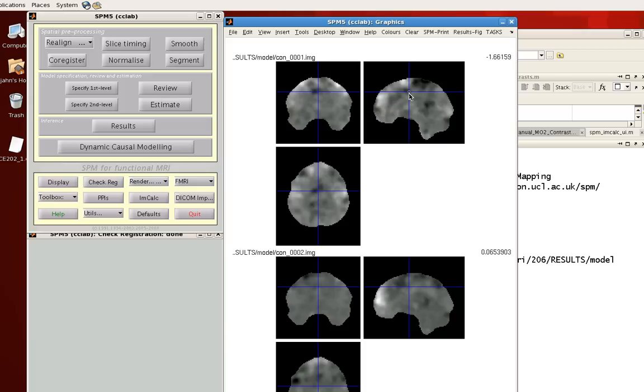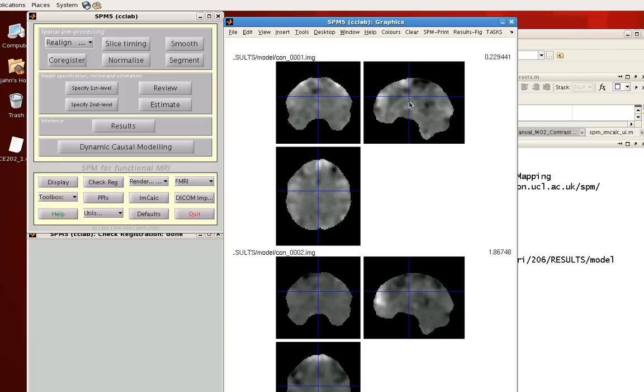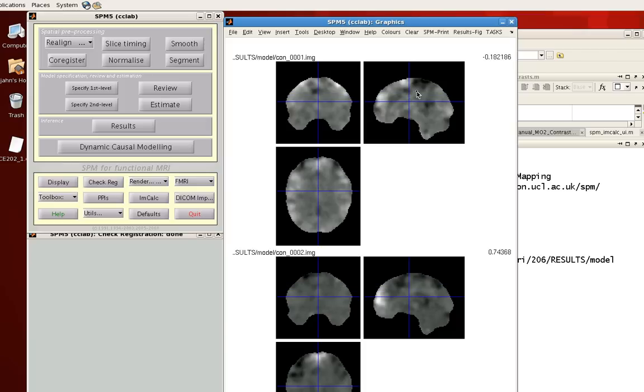Alright, so contrast1, contrast2. And notice that I can see the actual value of the voxel up here in the right-hand corner.